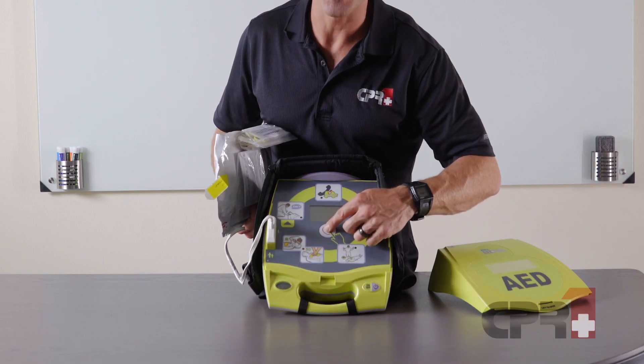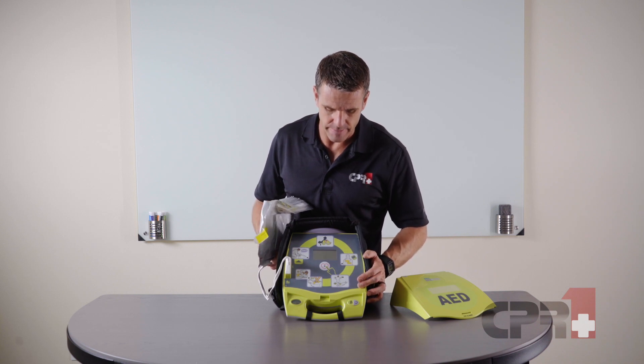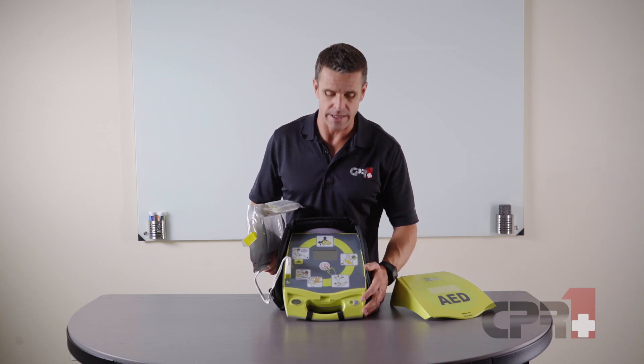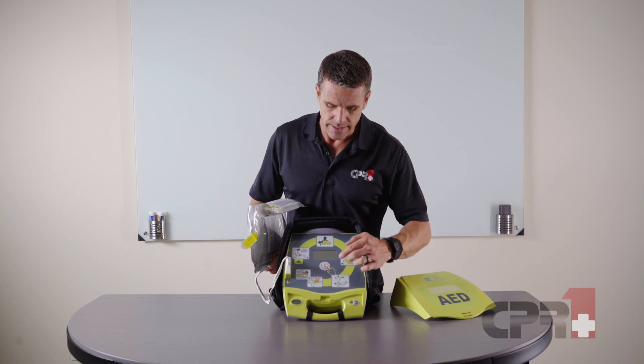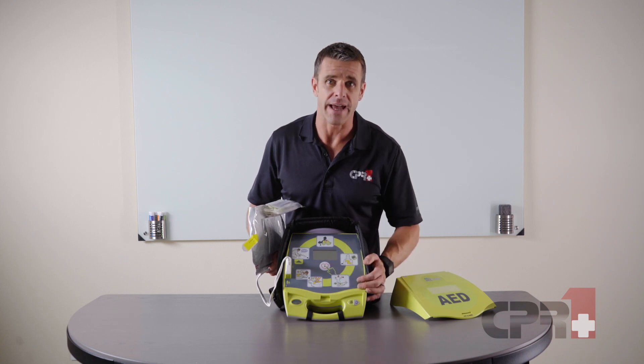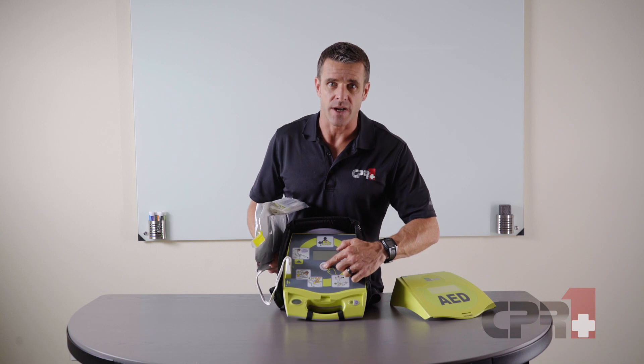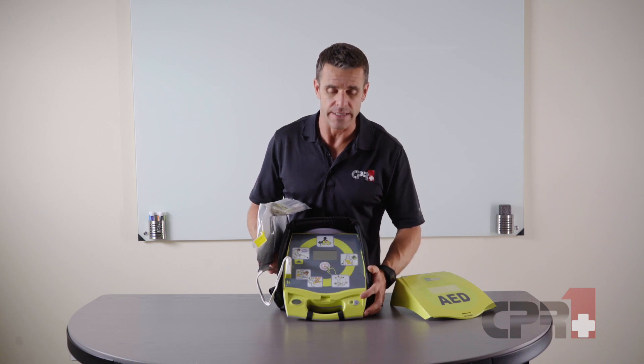Here's the shock button. This particular model is a semi-automatic AED, meaning it's going to tell us when it's time to initiate a shock and will activate the shock button at that time, but we have to actually press the shock button to initiate the shock.